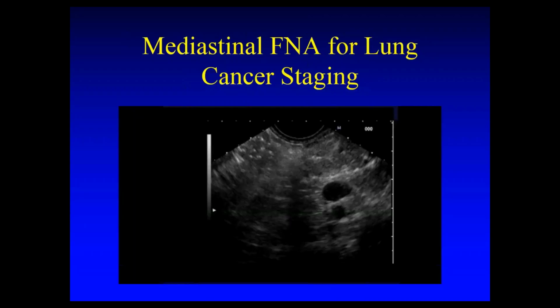You see there's a big lymph node here, about 2-3 centimeters or so. You can see that there's a 25 gauge needle going through this lymph node to obtain a tissue sampling. And just know that this is beyond a diagnostic test. It's even more so a staging procedure, because in the patient that has subcarinal lymph node, they already have stage 3A disease, making them not resectable, at least not immediately.